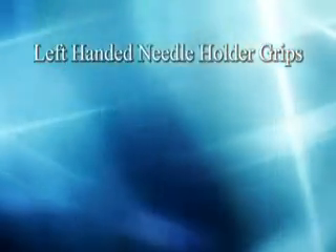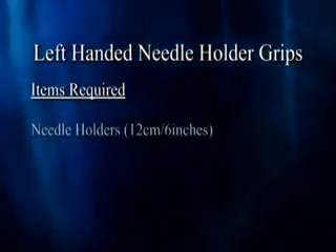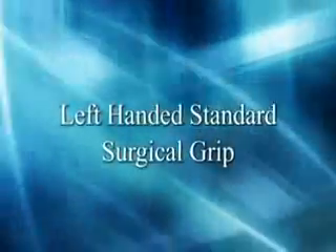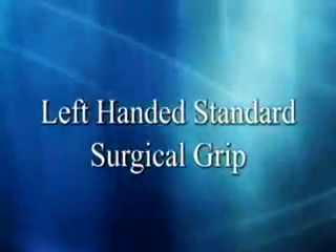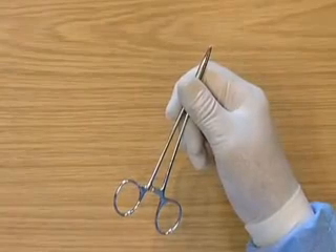Left handed needle grips. Items required: needle holders. This is the left handed standard surgical grip.